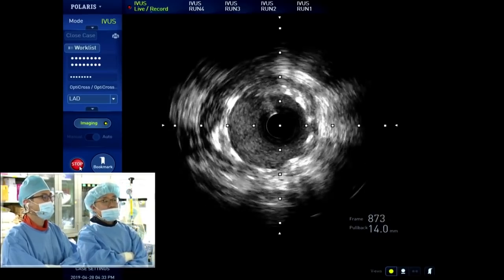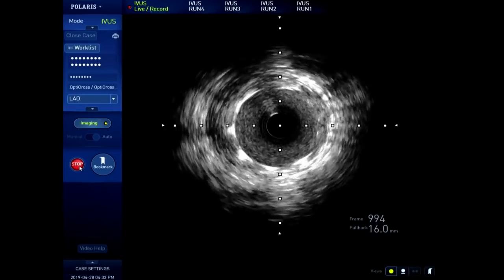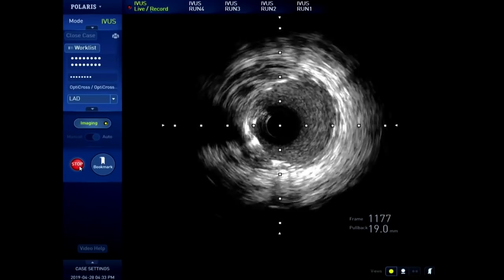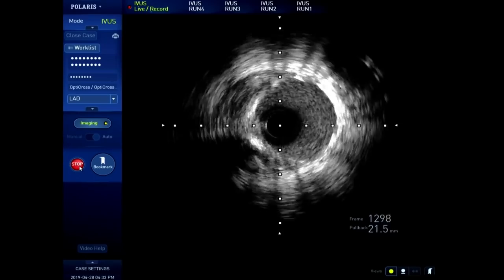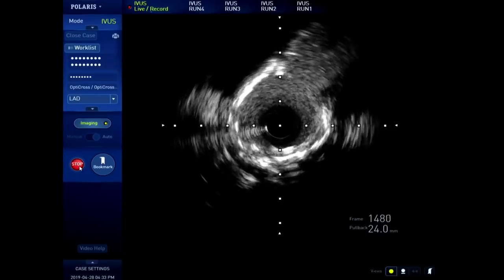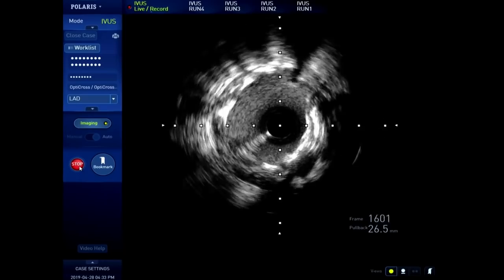If I have to place two stents, now I do almost always T and protrusion, TAP. Much easier, less distortion of the stent on the circumflex, and better ostial coverage. This is the coming of the circumflex, and this is the ostium of the circumflex.